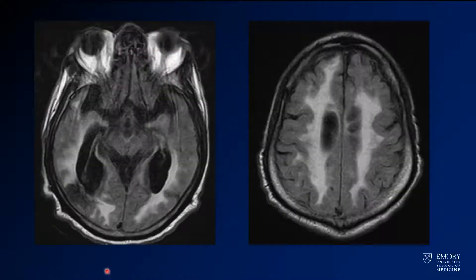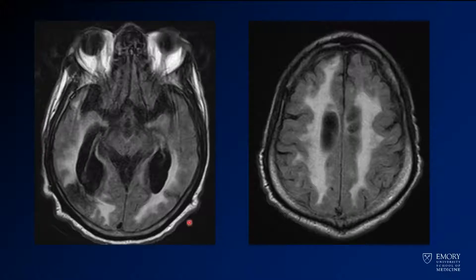Here we see an MR through the same level. We've got some susceptibility in that area, but again we see extensive white matter abnormalities throughout the entire brain — essentially confluent white matter abnormalities, so much that you would call them severe. Definitely some volume loss. These ventricles are far too large even for a patient of 81.